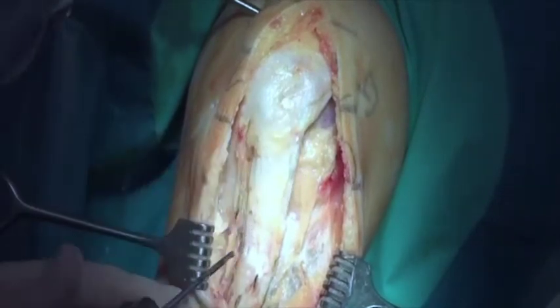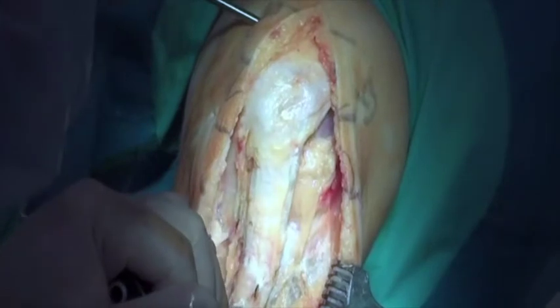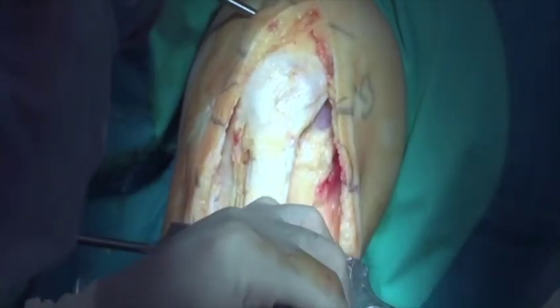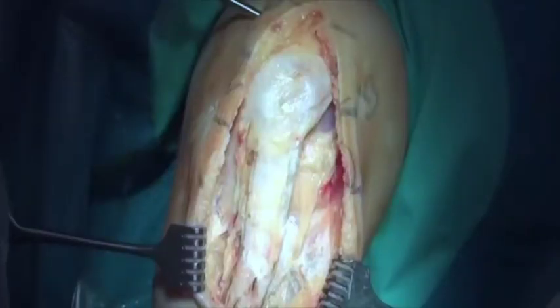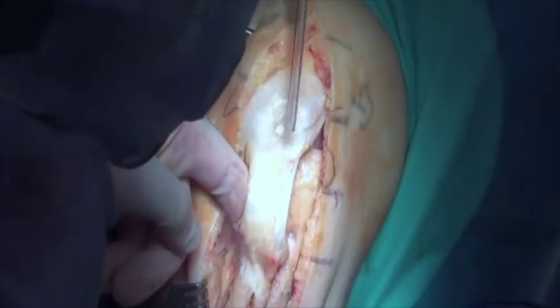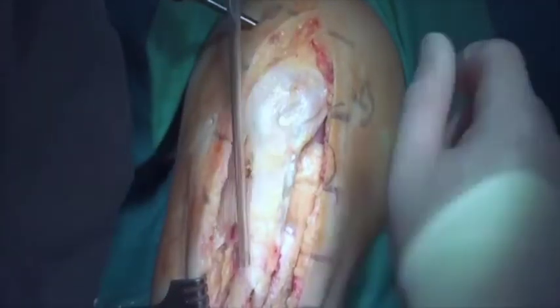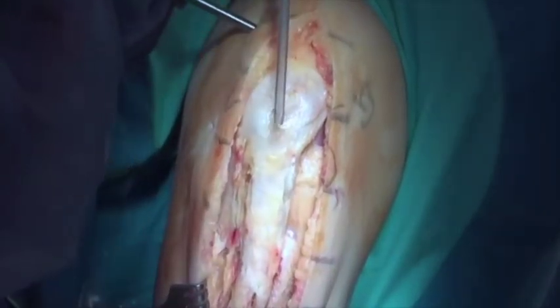Aiming parallel to the posterior tibial slope, the near cortex is drilled with a 4.5 millimeter drill in the desired positions for the two screws. Care is taken not to penetrate the far cortex, and the screw holes are slightly offset to prevent formation of a stress riser. An oscillating saw is then used to score the cortex, outlining an approximately 1.5 by 3 centimeter long bone block. Care is taken to preserve enough bone on either side of the screw holes to prevent the block from splitting when the screws are placed.